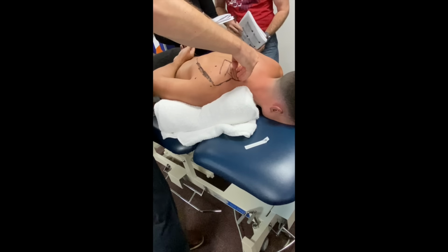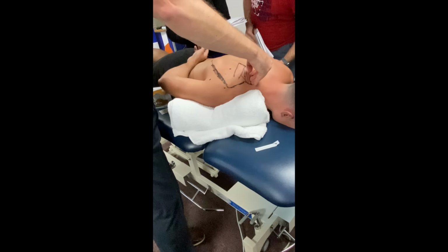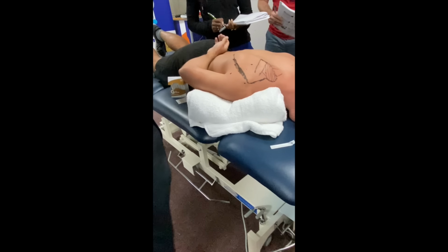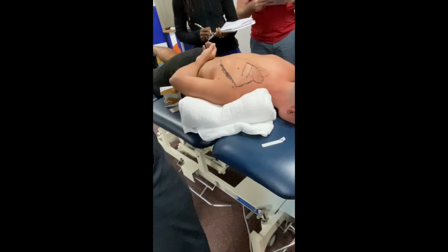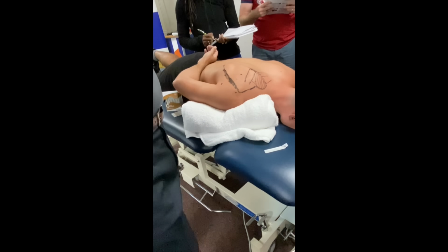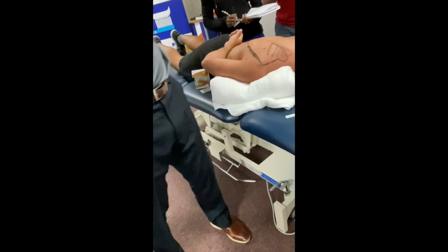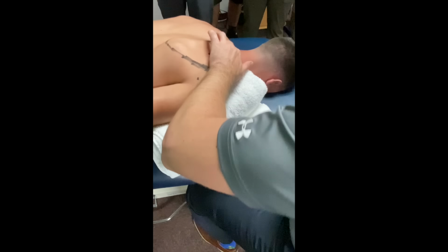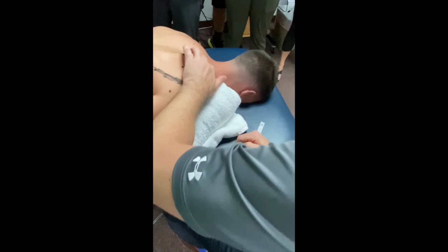So I'm going to go to where the skin is. I'm going to pull it out, and I know that it took that much needle to hit the scapula. That's the depth to his scapula. I would say that that's 20 millimeters. Get my dirty fingers over the vertebral border, over the vertebral border. This is where I want to needle.